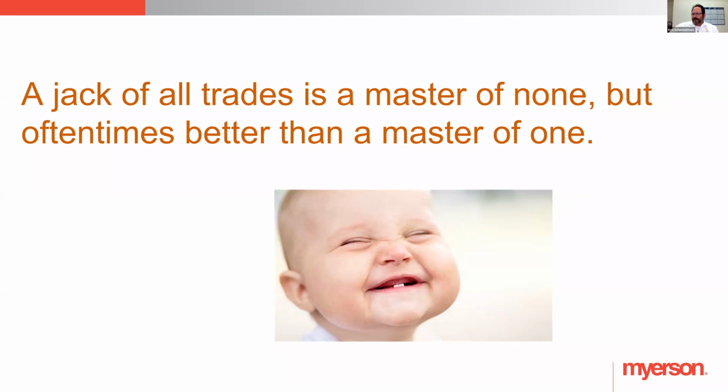Do you think that Trusana will open up to other printers? Yes, for sure. They have other printers on the horizon right now that will be coming out, some very shortly, and then some, they're just kind of picking and choosing. It's difficult to do, because you've got to understand, whenever they validate, they don't necessarily always change the printer settings for the material. Sometimes they actually have to change certain things in the material to allow for it to work best with that individual printer.